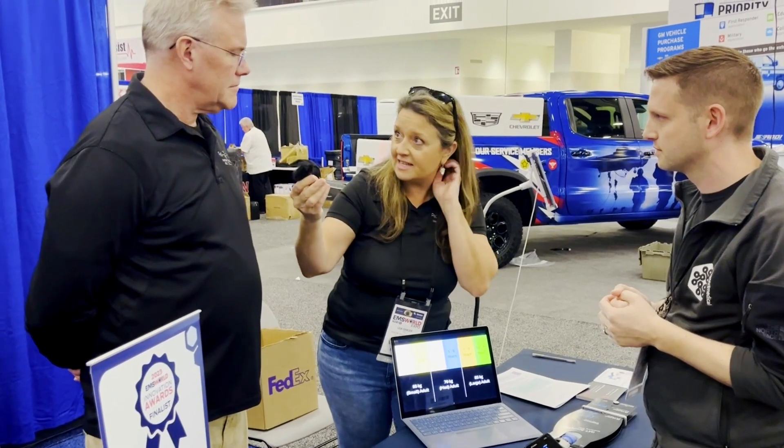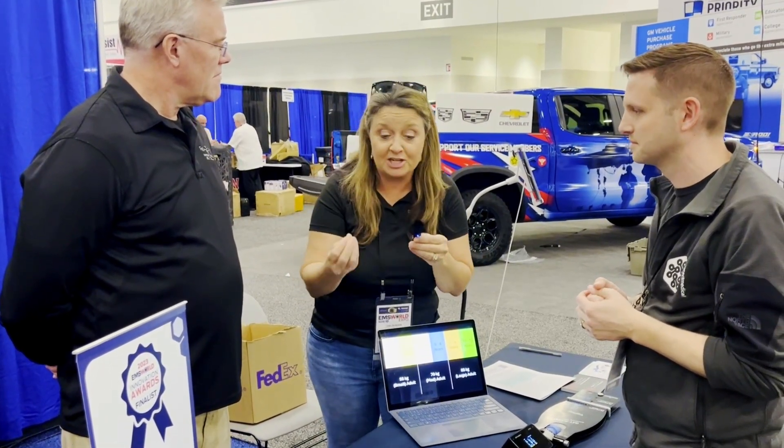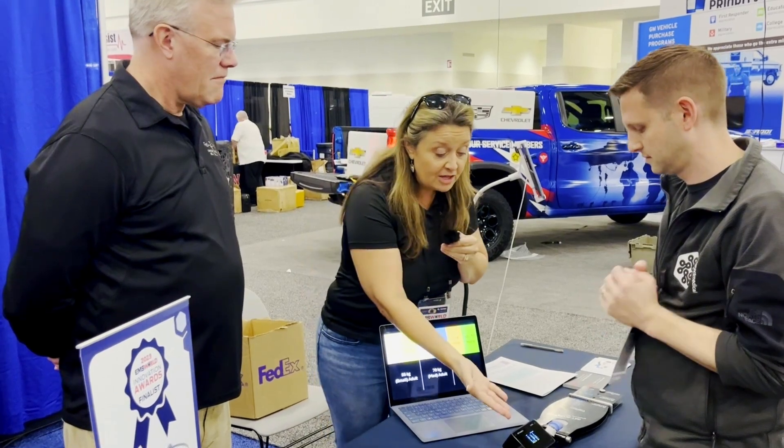That's one of the reasons we wanted to do this — so often when we have a really critical child, the stress causes us to over-ventilate these kids. In our class, we talk about bagging way too fast and way too hard. That's why we were very excited when you started working on this invention — this is something that's a game changer, potentially, for kids.